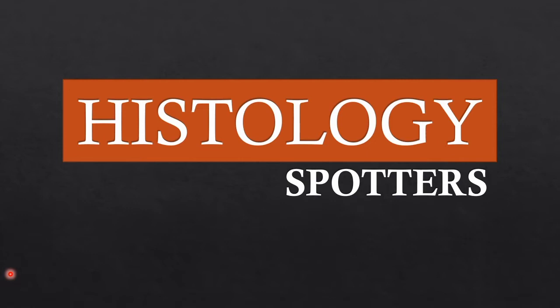So today we are going to discuss histology spotters. As you all know, histology plays a major role, and it is also a bit complicated in the practical examinations. Finding the slides is very difficult, because so many slides are similar. So in today's class, we are going to see how to identify the slides.